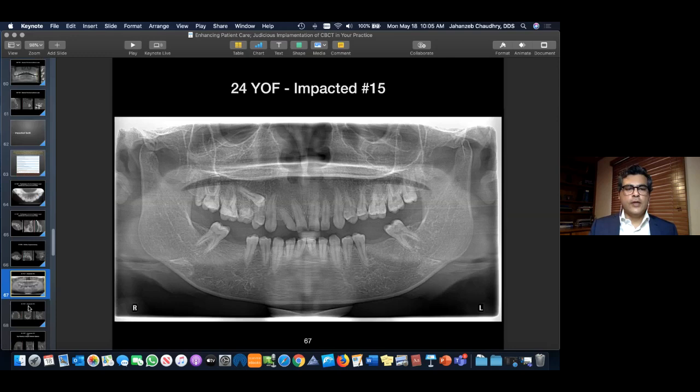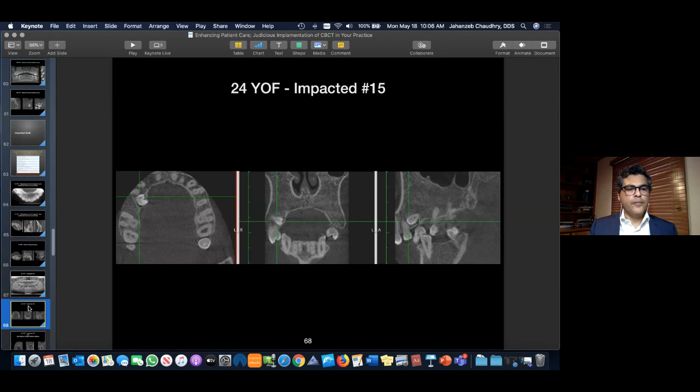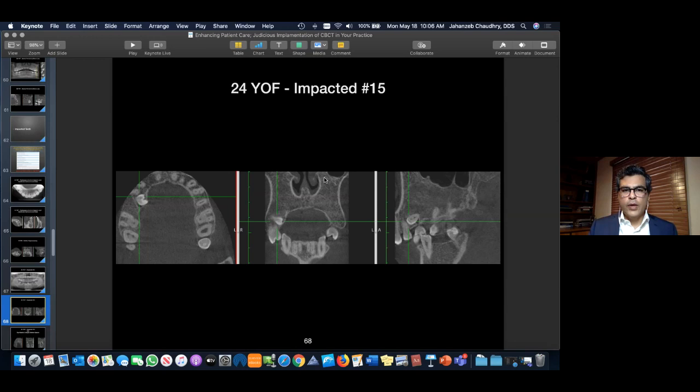So we asked the patient, and the patient in fact had a blood disease, a blood dyscrasia, which when it manifests in the jaws looks exactly like that. It causes increased vertical dimension, more specifically of the mandible, but here also of the maxilla, and we can clearly see that because of the large amount of bone marrow, the trabeculation has become really sparse.